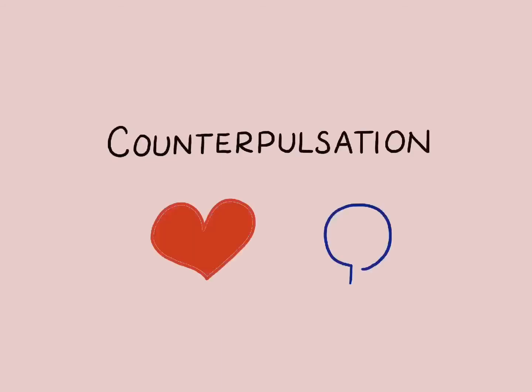To understand a balloon pump and how it works, you have to understand the concept of counterpulsation, which basically means you're pulsating counter to the action of the heart. So the heart pumps and then the balloon pumps, and that repeats over and over.